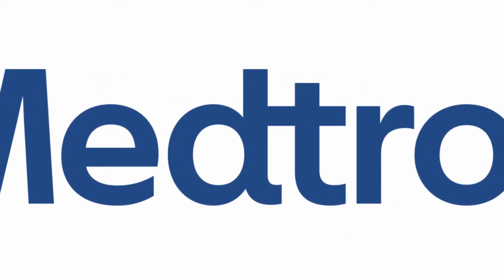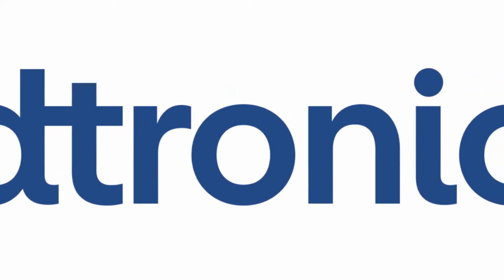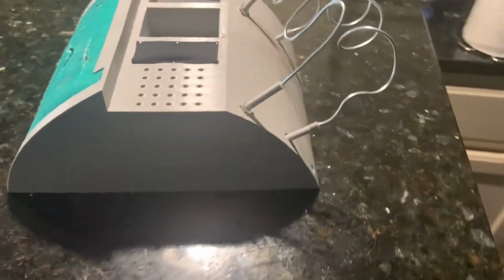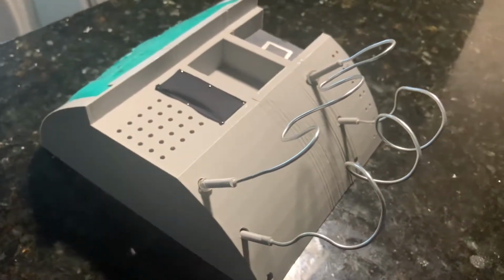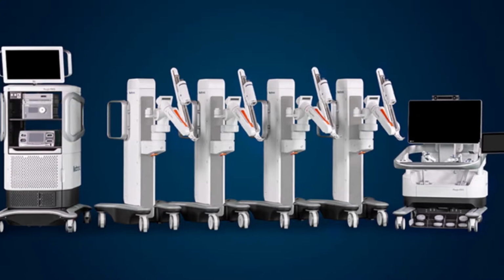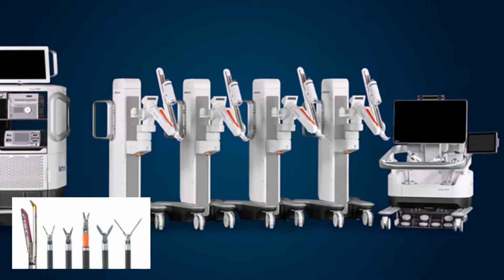Medtronic, a prominent medical device company, has been advancing robotic surgery since the field's conception about 20 years ago. Medtronic has tasked us to design a specialized device for internal, non-clinical use to collect feedback on the functionality of the RAS system. An RAS system has 4 arms, one of which is equipped with a camera, and the remaining 3 can be outfitted with surgical tools.